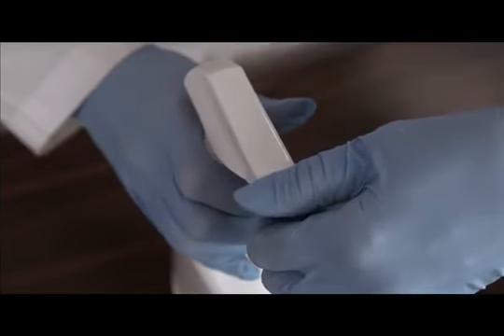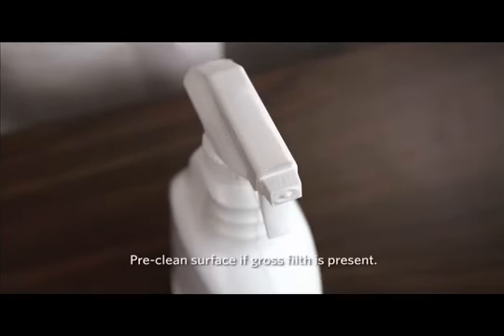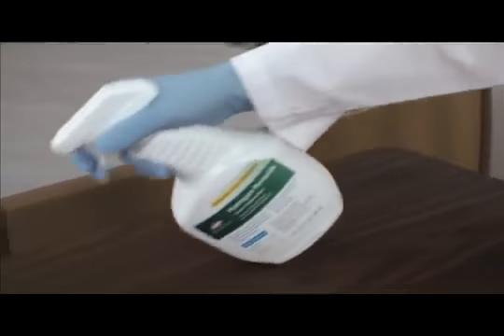First, turn the nozzle to the on position. If gross filth is present, be sure to clean prior to disinfecting. Then spray 6 to 8 inches from the surface until it is completely wet.